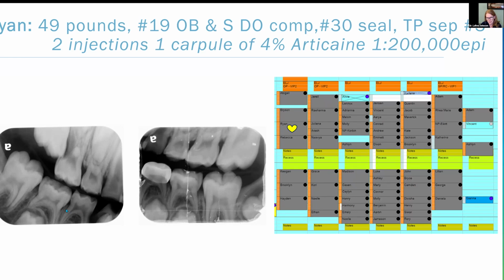And in fact, when I look at the bone, for example, between S and T, I'm like, yeah, that could be a little tricky there. Between T and 30, it's a little less organized. Look at how dense it is, for example, between J and 14. Start looking at these things. You really don't want to stick your needle where the periosteum is highly organized, corticated, and opaque. That's where you're asking for trouble.